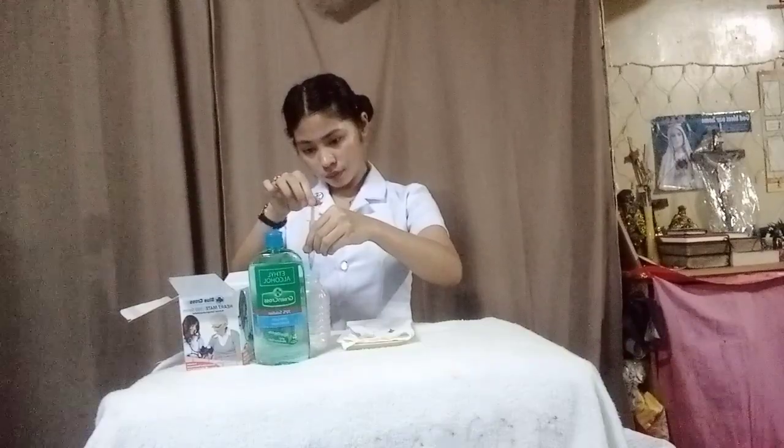And now inject it into the vial. Now there are no air bubbles, so we can just cap it and place it on the hypodermic tray, and then write the drug name and dosage on the medication ticket and place it into the hypodermic tray.